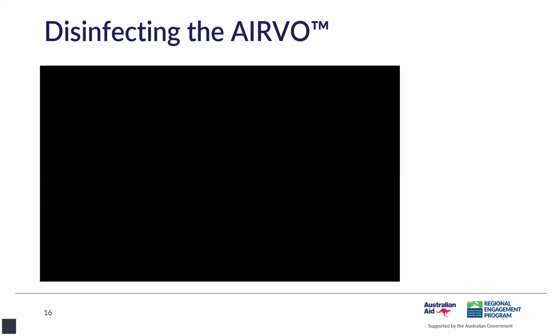The key take-home message from this video is do not throw out the red tubing. It is like gold. If you throw that tubing out, you are unable to disinfect the machine in between patient uses. And they're really, really expensive to replace, as you may or may not already know.